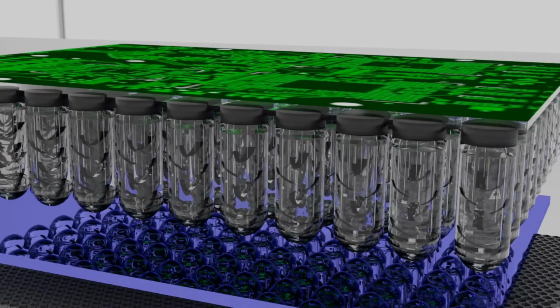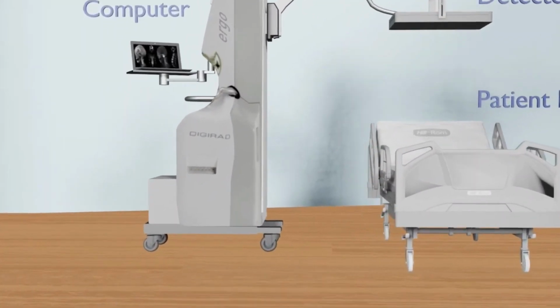Typical PM tube sizes are 5 centimeters in diameter. Most modern cameras employ between 30 and 100 PM tubes. The PM tubes are encased by a thin magnetic shield to prevent changes in the gain caused by changes in the orientation of the gamma camera relative to the Earth's magnetic field.